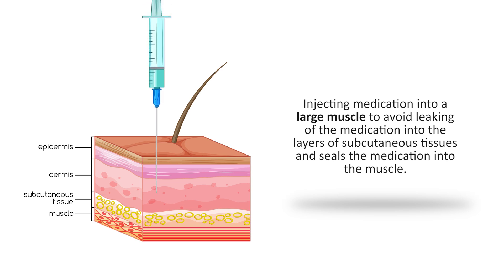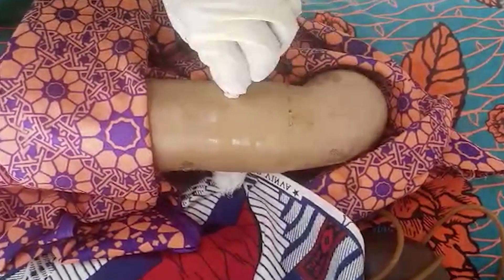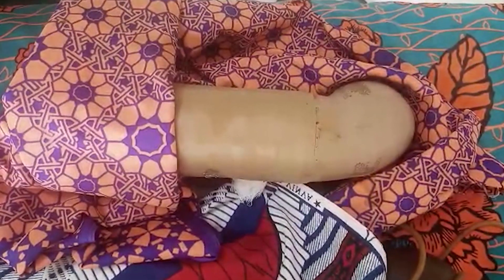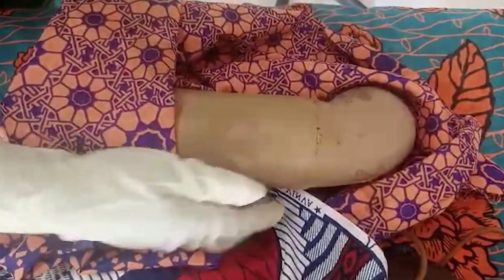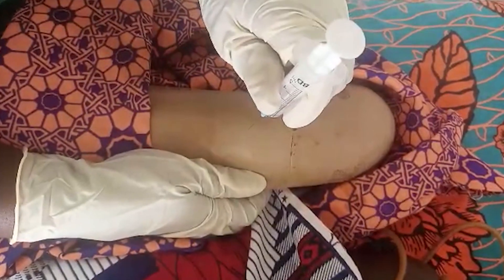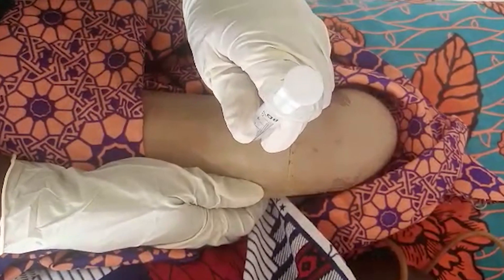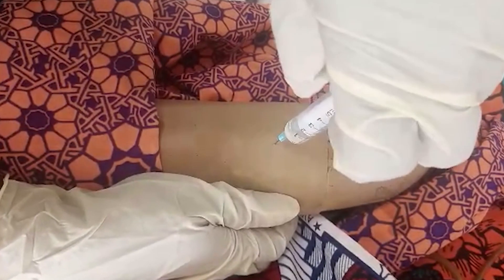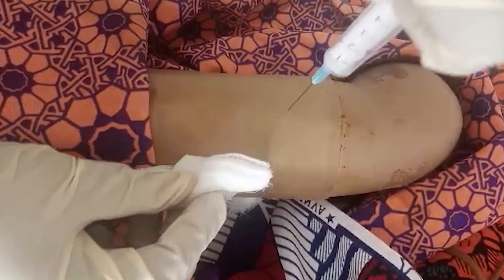Method one: the Z-Track method is used when injecting medication into a large muscle to avoid leaking of the medication into the layers of subcutaneous tissue and seals the medication into the muscle. With the non-dominant hand, displace the skin and subcutaneous tissue two to three centimeters sideways to begin the Z-Track method. Keep the non-dominant hand in place throughout the injection. With the dominant hand, hold the needle at an angle of 90 degrees. Inform the patient, then quickly insert the needle using a dart-like motion into the skin, aiming to inject where your non-dominant fingertips had originally been, until about a quarter of the needle is left showing.